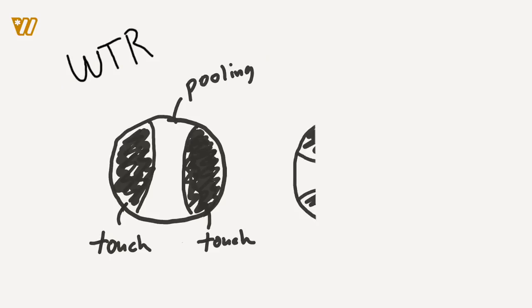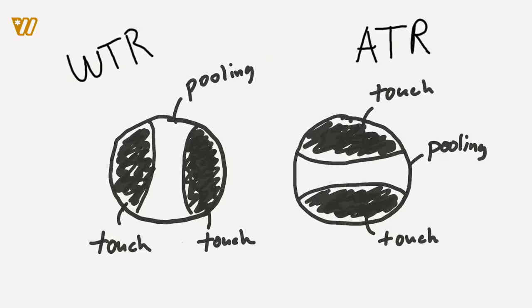So now let's talk about an against the rule cornea, right? So an against the rule cornea, you're going to have the exact opposite situation, right? So an against the rule cornea, remember, we're going to have a flat meridian vertically, right? And the steep meridian is going to be horizontally, right? So what's going to happen there is you're going to see touch in the vertical aspects underneath your GP contact lens, and you'll see fluorescein pooling in the horizontal meridian.